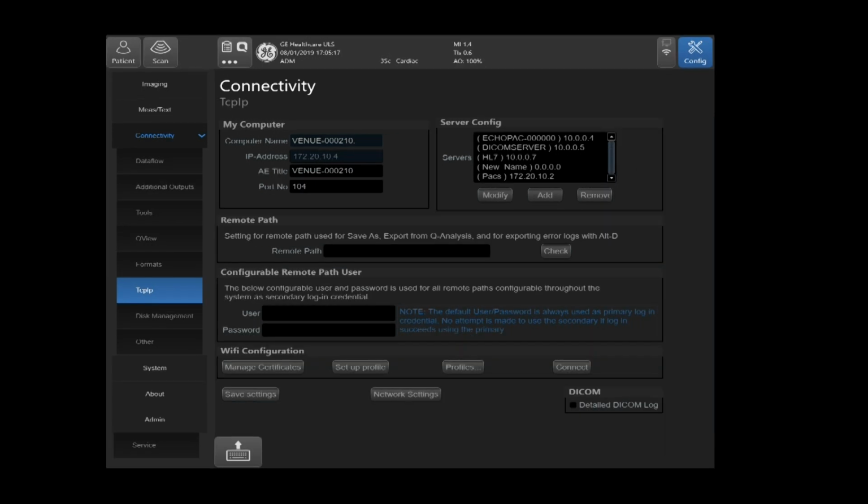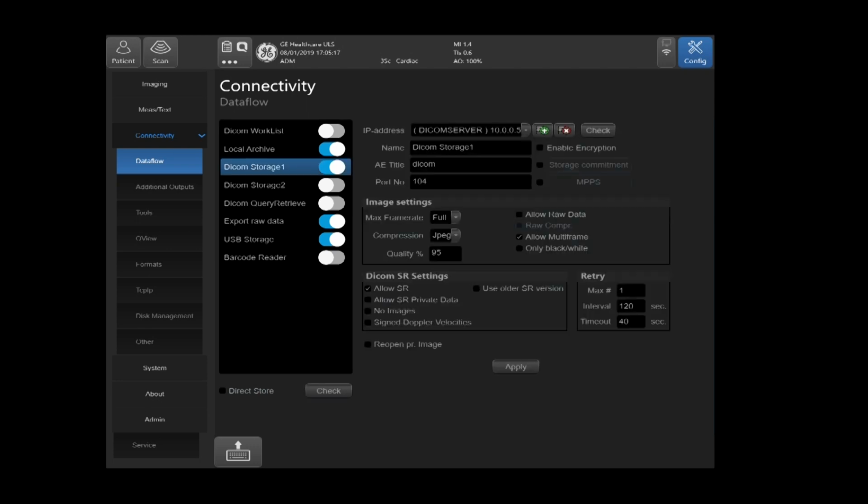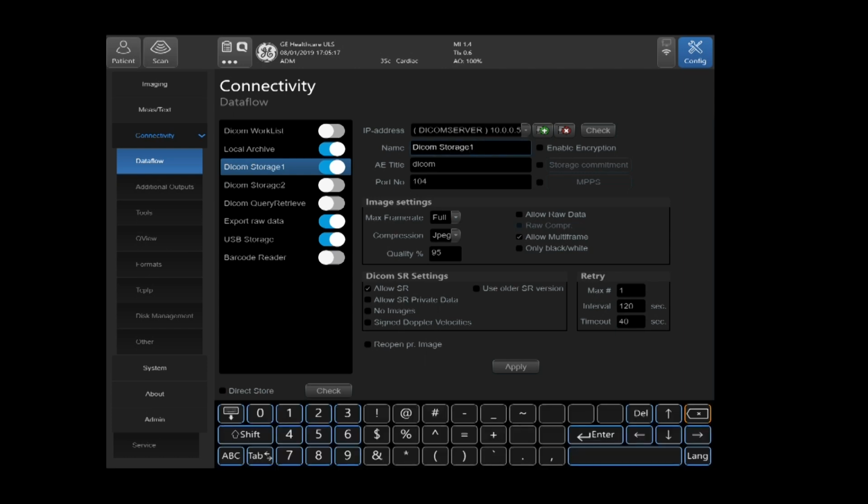Now we're going to go ahead and configure the data flow for the PACS. Select data flow. Under data flow, you'll see DICOM storage 1. Select DICOM storage 1. And you'll see the indicator to the right hand of DICOM storage 1. Blue means that service is turned on. And that means as soon as you're done configuring this and you end your exam, it's going to send to the PACS at the end of the examination.